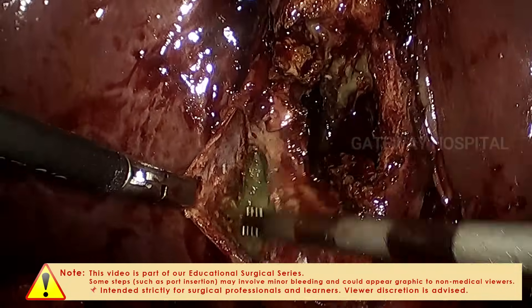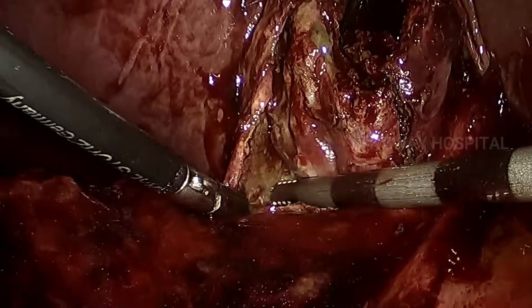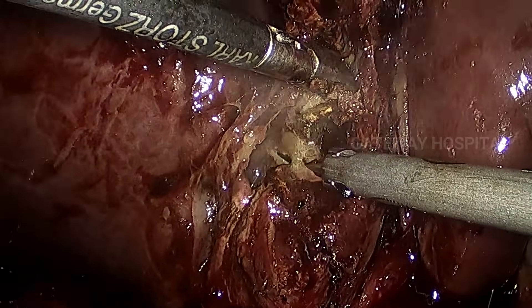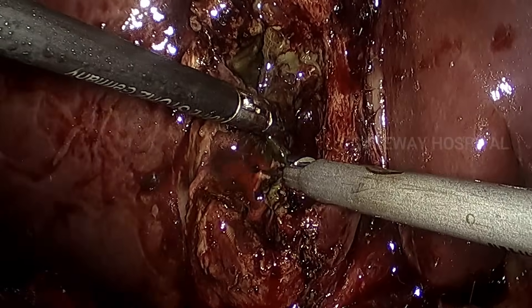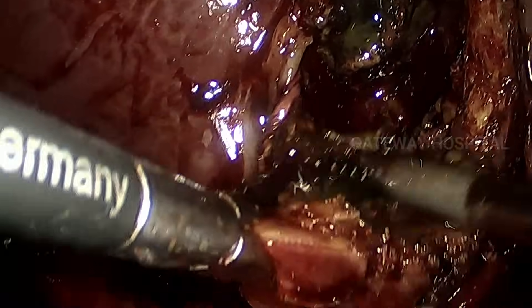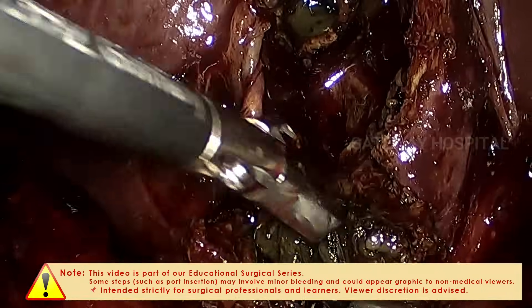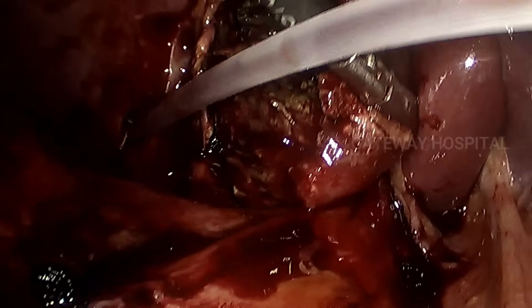Once you are aware of the remaining gallbladder depth, you can easily dissect the leftover gallbladder and go into the cystic neck and apply an endoloop to the cystic duct. We are in the process of completing the circumferential division of the gallbladder. While dividing the posterior wall adherent to the liver, be very careful not to go deep into the liver parenchyma or injure nearby structures. We are looking into the infundibulum to assess the remaining depth, and very importantly, you should identify any stones impacted in the cystic neck — if present, they should be dislodged and removed.